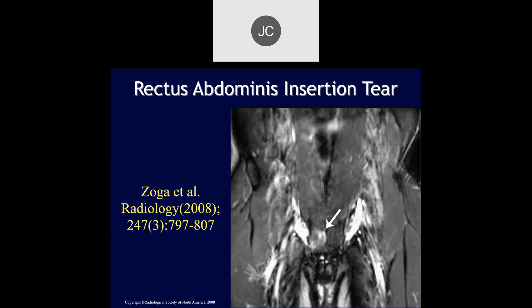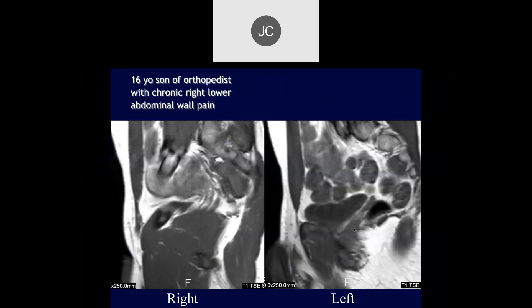Pointing at the rectus abdominis — you can see a lot of edema here. Here are the neurovascular bundles on either side.